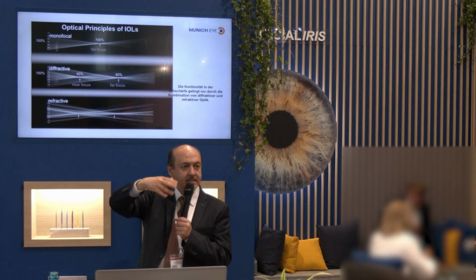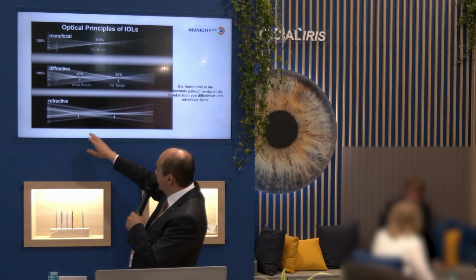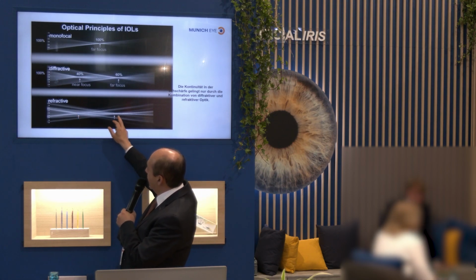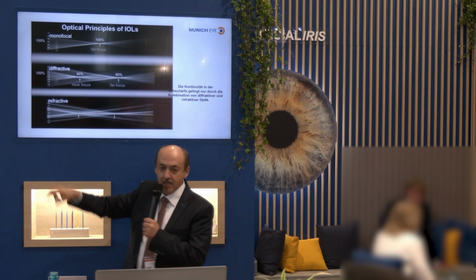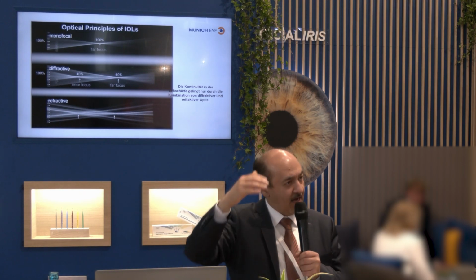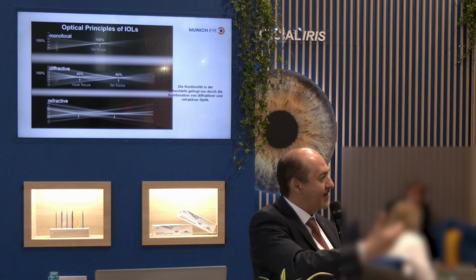This is a segment lens as you know it, with a near segment at the bottom. This essentially distinguishes the 2 foci. You can also see that light is already being concentrated in between. This means that the hard edges, the sharp transitions where it becomes blurry, are not present. They are softer, more physiological.